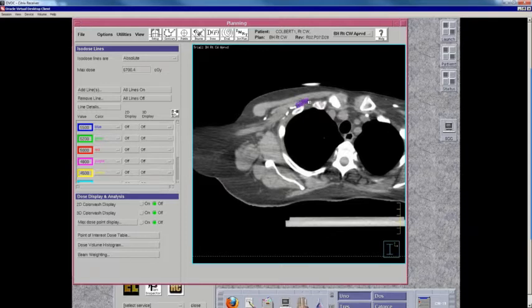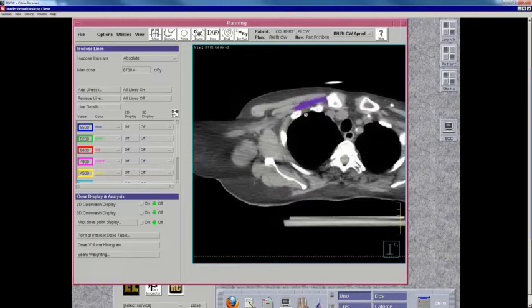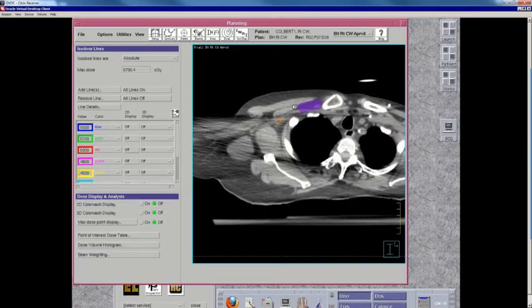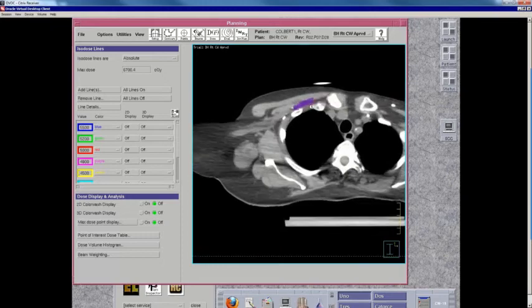So now I'm going to contour the level 3, which is essentially the lymph node bearing tissue, which is superior and medial to the edge of the surgeon's dissection. I'm using her initial CT scan to help inform my understanding of where her malignant nodes were in this region. Typically I contour medial to the pec minor, deep to the pec major, up to the clavicle, and all the way down to about the ribs. Now, this isn't my only target because I also want to target Rotter space in this patient, but just to keep things clean and simple, this is typically what I contour.